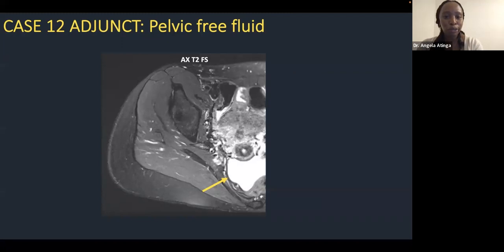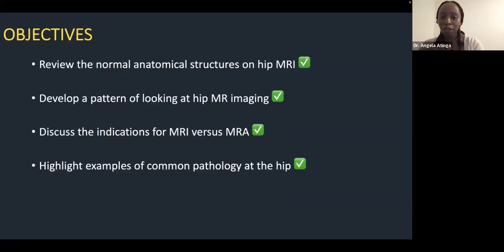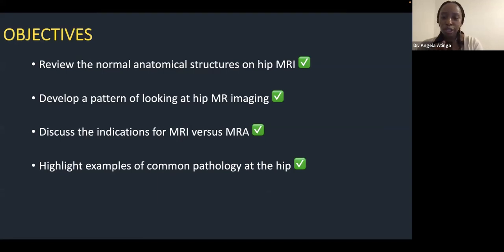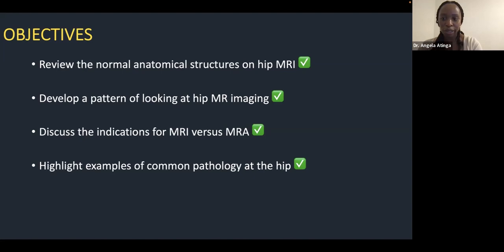In summary, we've had a quick run through of the normal anatomy of structures at the hip, developed a pattern of looking at hip MRIs, discussed MRI versus MRA, and looked at examples of common pathology. There's much more to cover — infection, post-operative cases, arthroplasty — but this is a good starting point for interrogating the literature and approaching cases in practice.